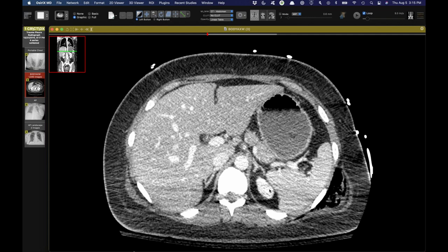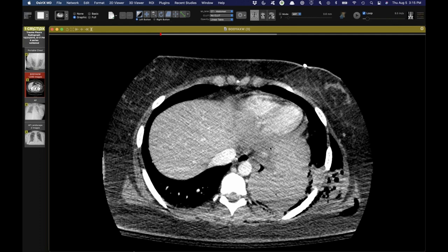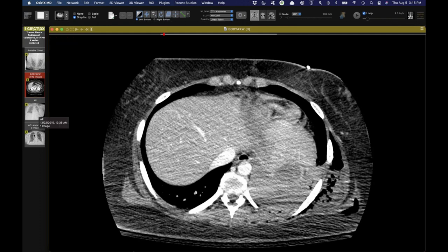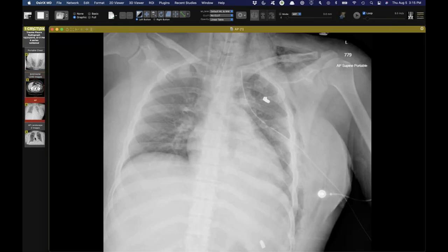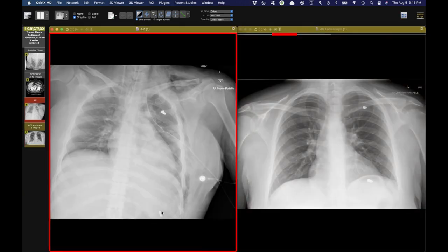So they went in, there was a diaphragmatic injury, no surprise, the bullet and the liver laceration that were repaired. The heart and the pericardium were okay. They didn't take out the bullet. The reason I saw this is that I saw a follow-up study on this patient. This was around the time of the incident, and then this is several years later. So she's recovered well, but she has a wandering bullet. So not a thoracolith, or I guess you could say it's a thoracolith of some sort, but it's clearly in the pleural space and migrating. So just important to remember, just because you see a bullet somewhere doesn't mean that's where it actually originated. It may be moving around, as it was in this case.